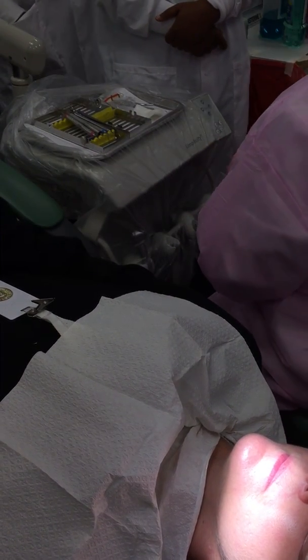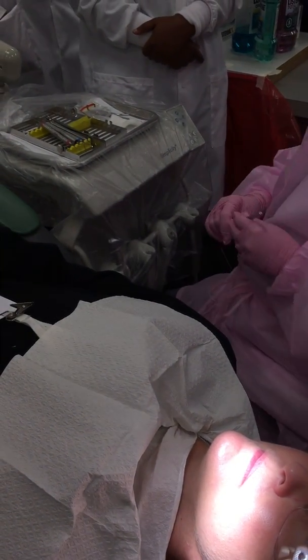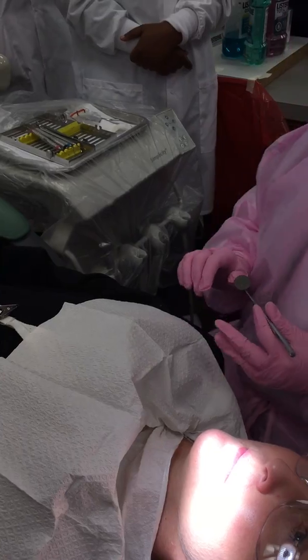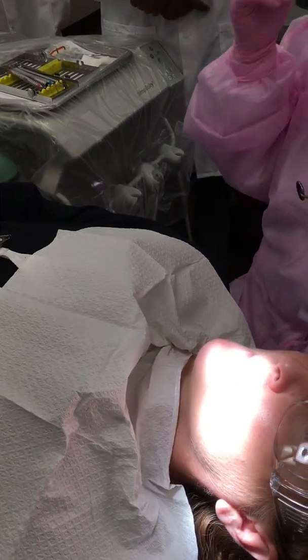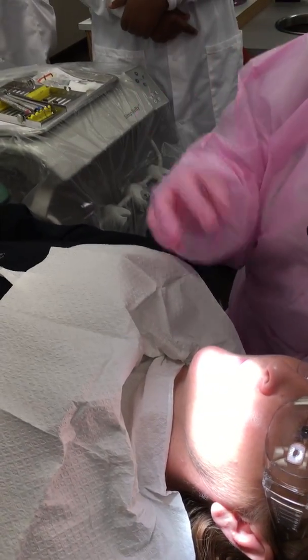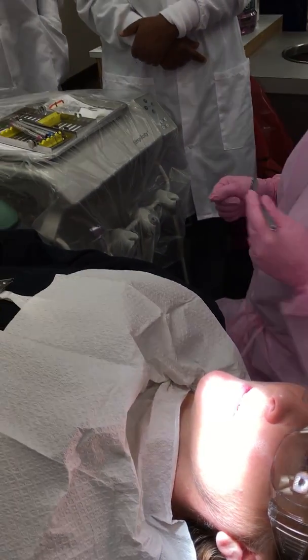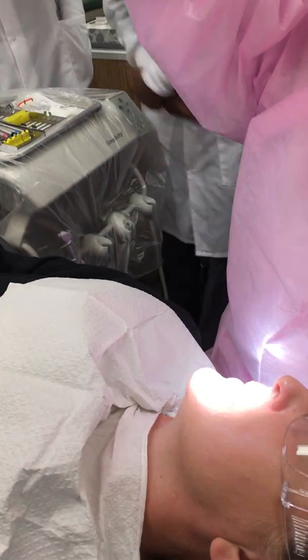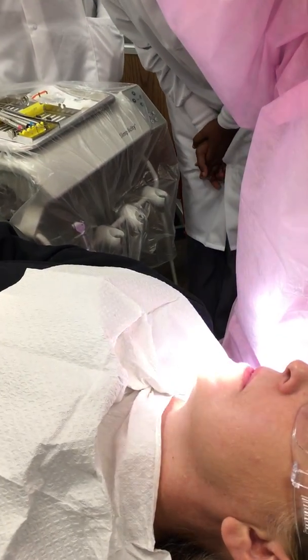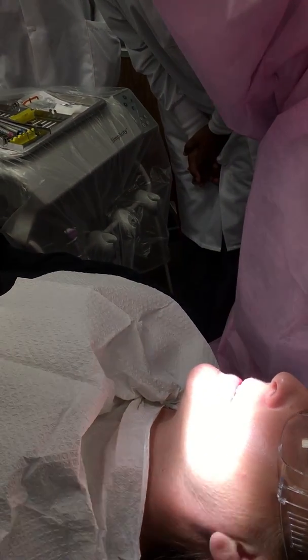Now, I would get used to knowing where your teeth are on your chart and where they are in the mouth, and make mental notes of where you find things so that you're not, oh, I found a 4, let me go write it down. Kind of keep in your mind where you're finding things, and do groups of teeth and then write. Okay? So, turn this way. Let's look at some anatomy that we talked about yesterday.